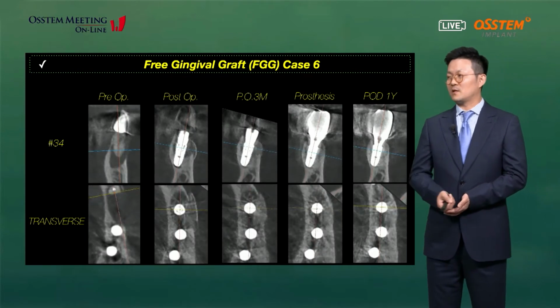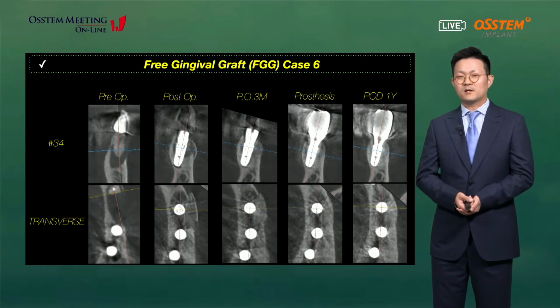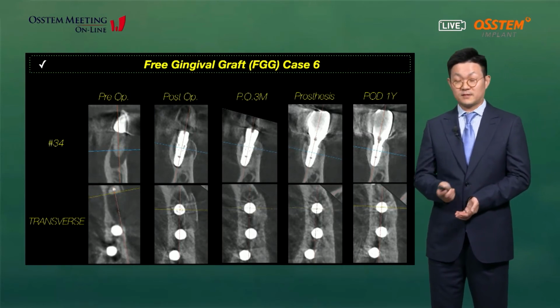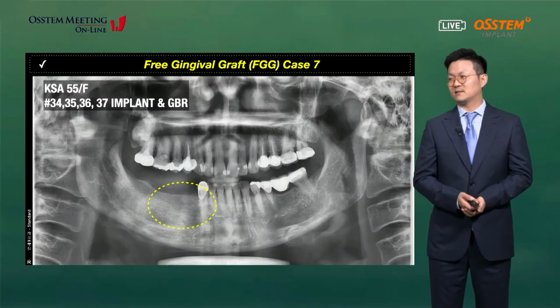So in the CT scan for more than 1 year, the buccal bone contour is, I think, in a very good state. So I finished this case like this.